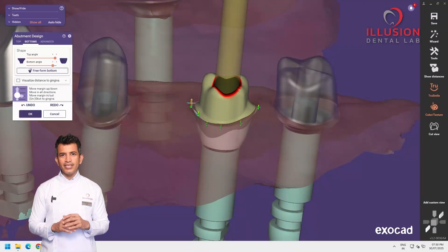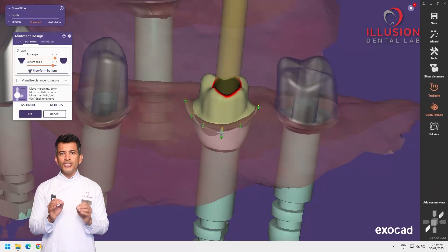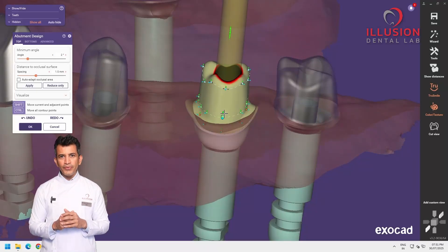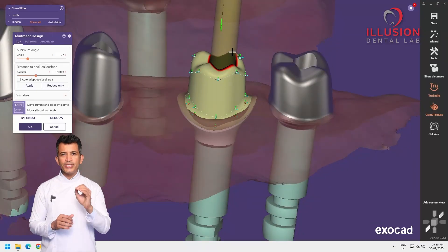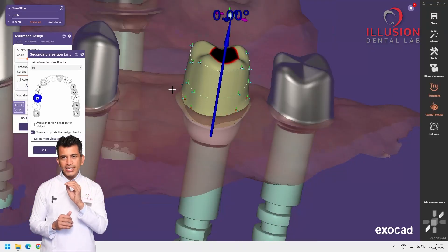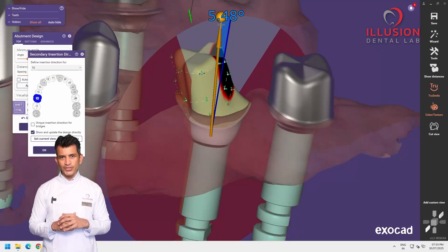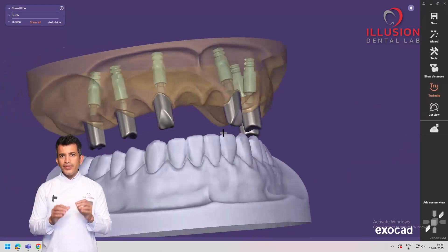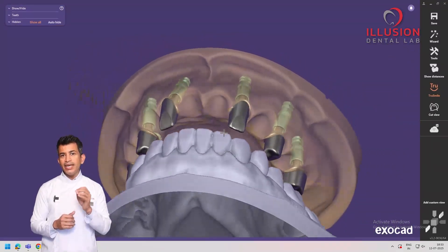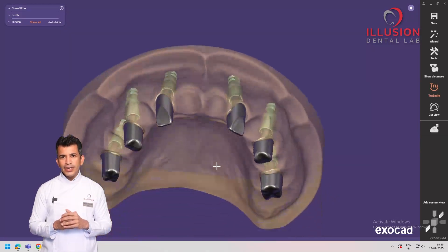This is where you see how custom abutments truly make a difference. Each one is designed as per the requirement of your case. Here we ensure accurate emergence profile, precise collar heights, optimized abutment height for prosthetic support, and corrected angulation for ideal path of insertion. As you can see, they overcome all the clinical compromises and limitations of stock abutments.